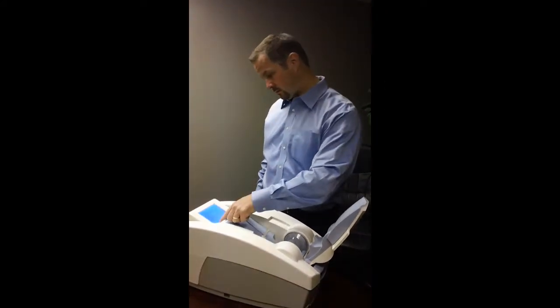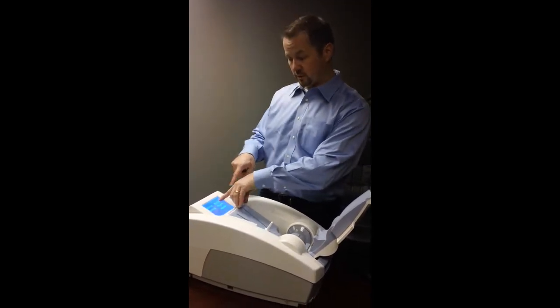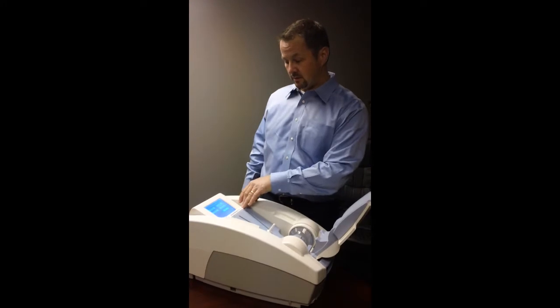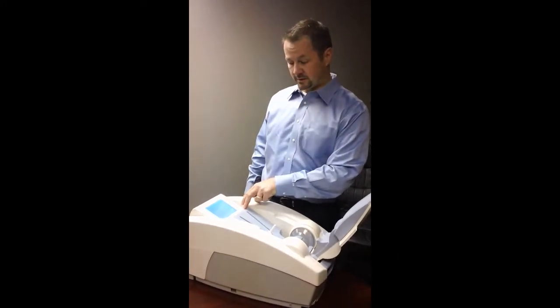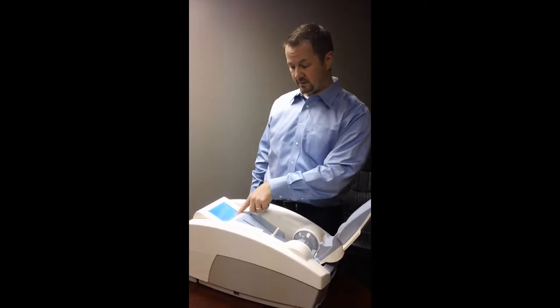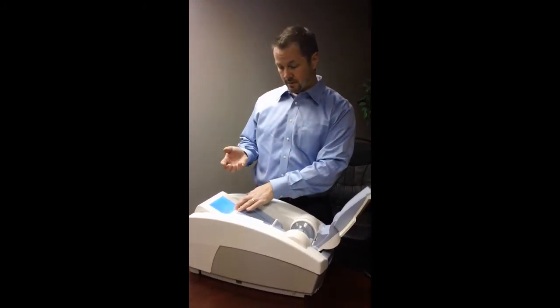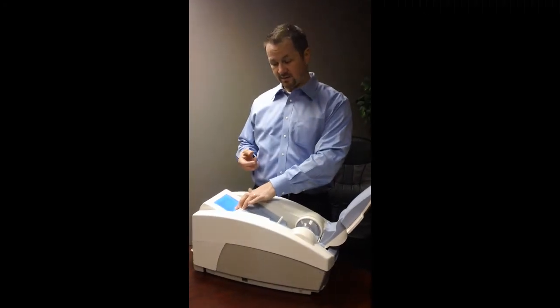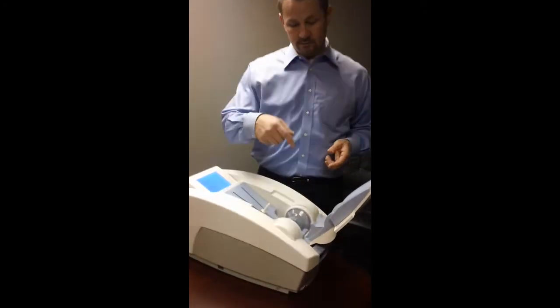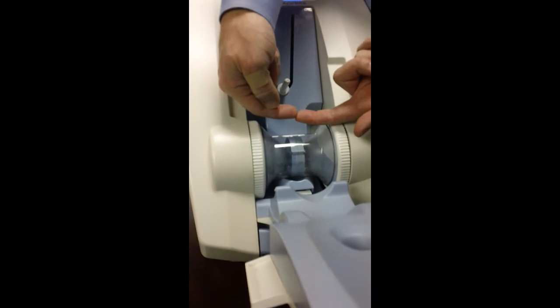Then you would go into the system and select that you want to do a QA. Once you select QA, it will tell you what your next actions are. It will say to you: spray the membranes, which I've done, put the cylinder into the unit, and then press continue. You can see how these membranes come out — the membranes will actually make contact with each other.